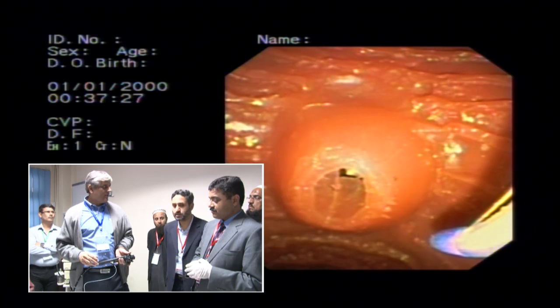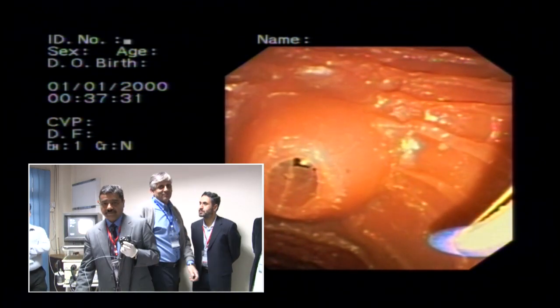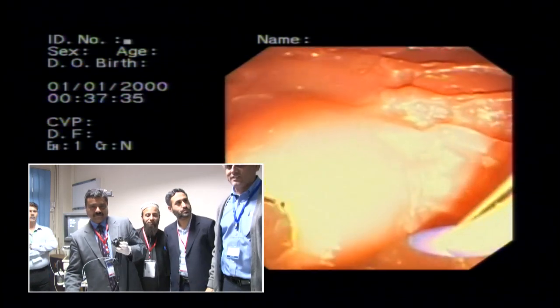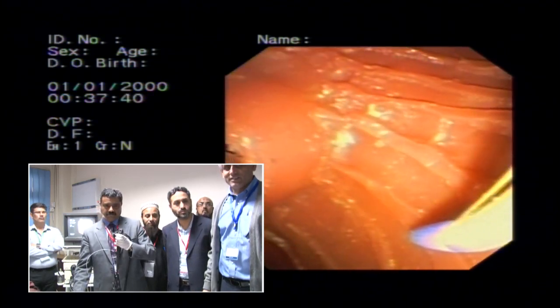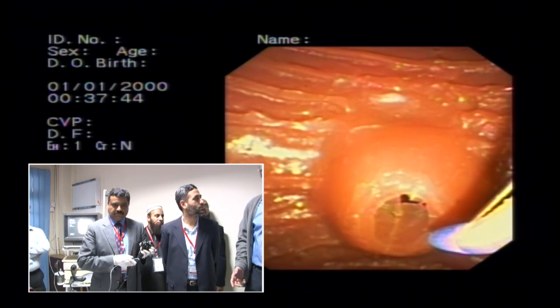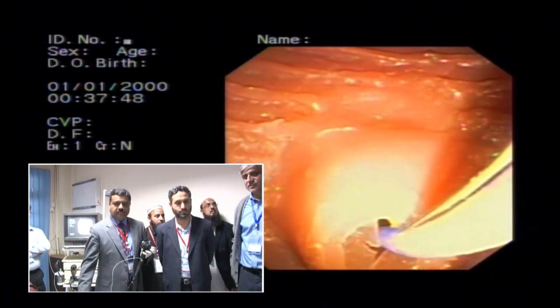सर एंटी फोम आप ज़्यादा यूज़ करते हैं? नहीं, I don't use. I'm very basic ERCPs. I don't use anything. Most of the things are not available. Glucagon we can't afford for every case or whenever we need. I use atropine, simple atropine. We dilute it with 9 cc and we get 1 cc. Usually 1 to 2 cc is the max.